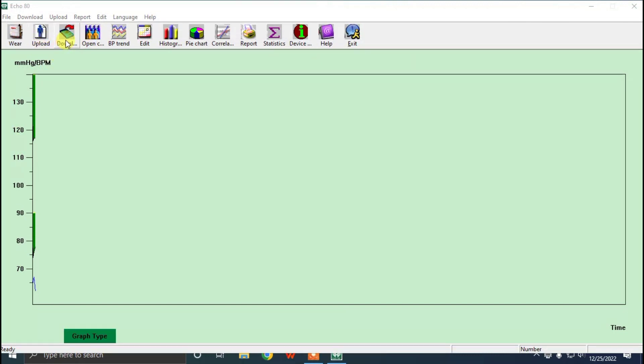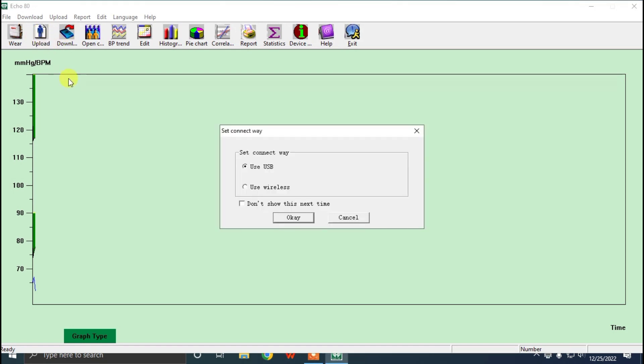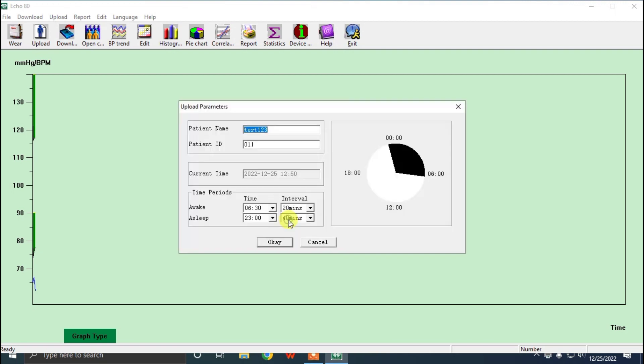Because some users are very confused in uploading and downloading the systems, we have created this video. If you have to enter a new patient, another patient, then you can follow the instruction like same as before.